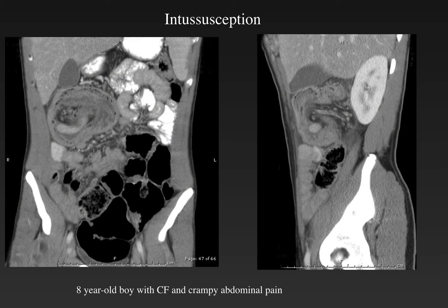Here is another example of intussusception causing obstruction. The child has cystic fibrosis and crampy abdominal pain. A mucus-filled, distended appendix serving as a lead point is seen in a colocolonic intussusception causing small bowel obstruction. A large fluid-filled appendix or the distal intestinal obstruction syndrome can be a cause of intussusception and obstruction in cystic fibrosis.